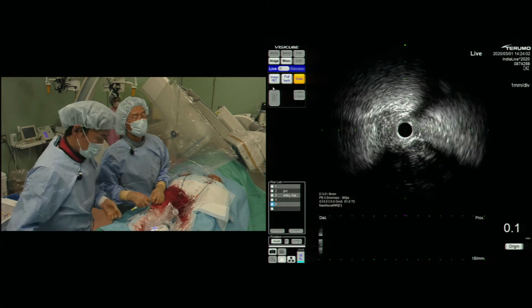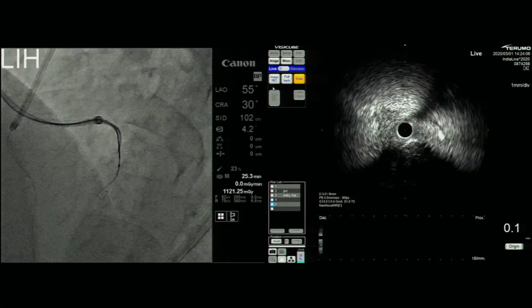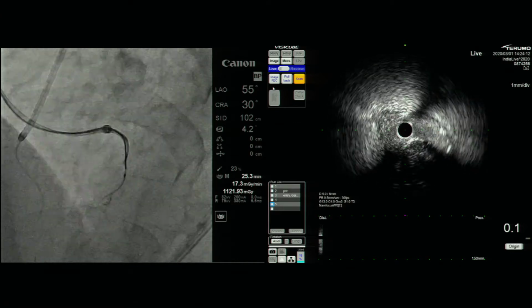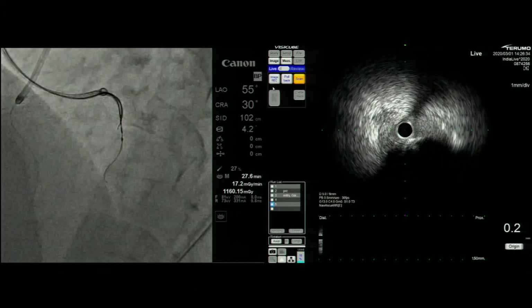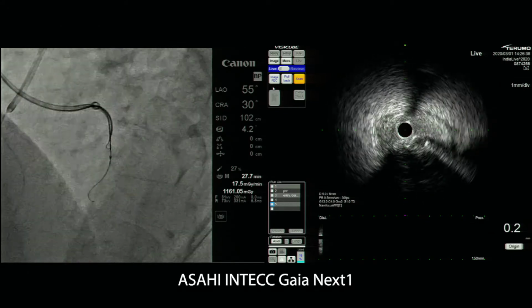So you're shaping it the same way as it was done the first time. Yeah, I did the reshape, same shape. Okay. Was it difficult to control? Are you sure that wire has penetrated? No, it's just tracking the vessel.